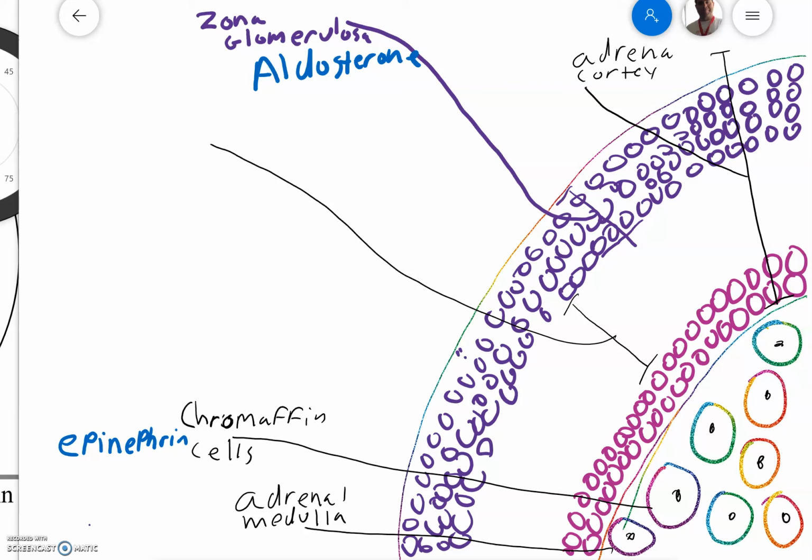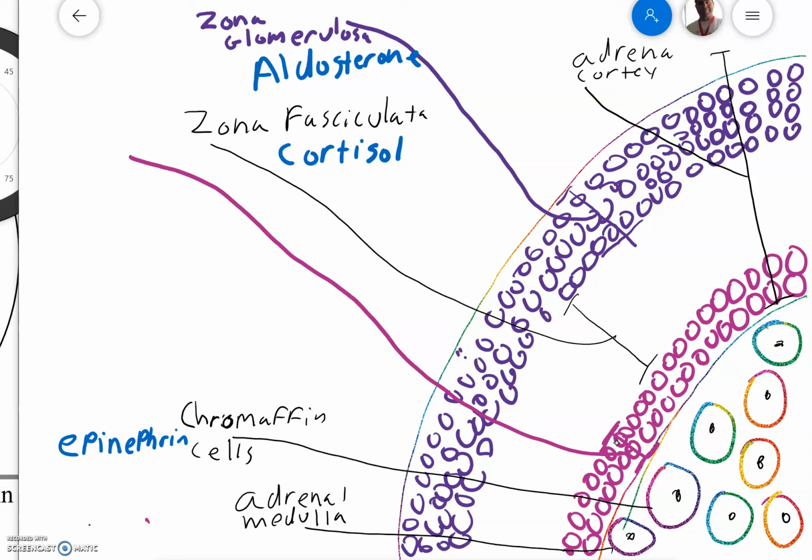This is the zone adrenocorticotropic hormone affects the most, and cortisol is a stress hormone. It releases fatty acids into the blood, it inhibits inflammation, it basically gets your body ready to expend energy and deal with stress. This last zone, usually the thinnest in the histology slides, is the zona reticularis, and it makes the sex hormones estrogen and testosterone in both sexes.